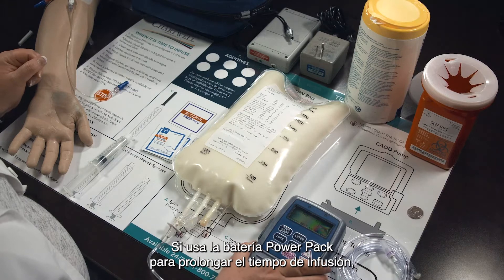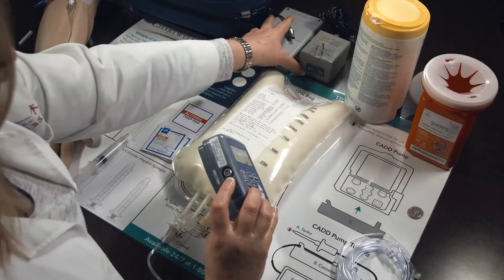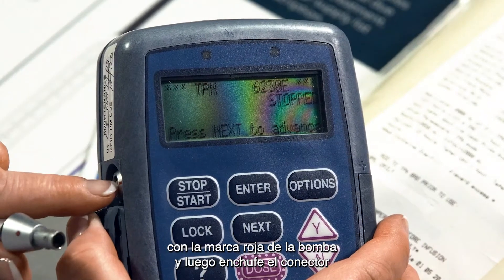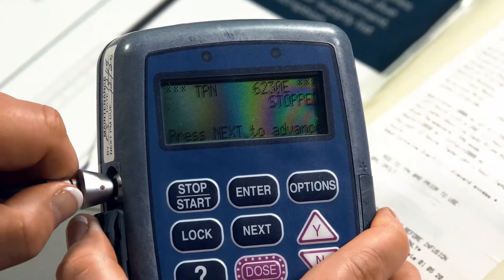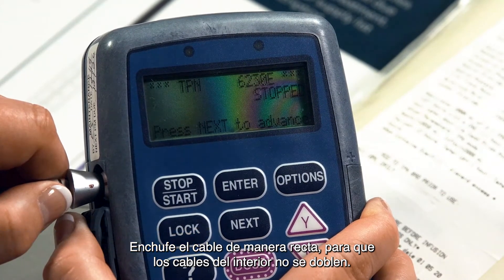If using the external power pack to extend the battery infusion time, open the rubber cover of the power jack on the side of the pump. Line up the red mark on the power pack's cord connector and the red mark on the pump. Then push the connector fully into the pump with a straight motion until it stops. Do not twist or turn the connector. The cord must be pushed in straight so the wires inside the cord aren't bent.